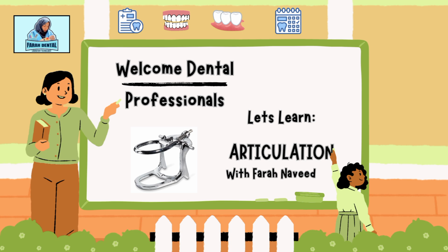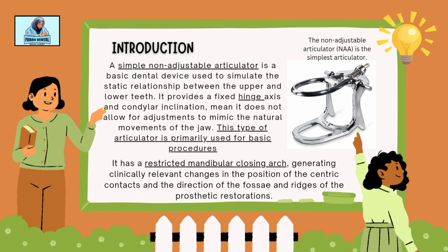I hope after watching my video demonstration you will understand it better. So let's start. We begin with the introduction of the non-adjustable articulator.